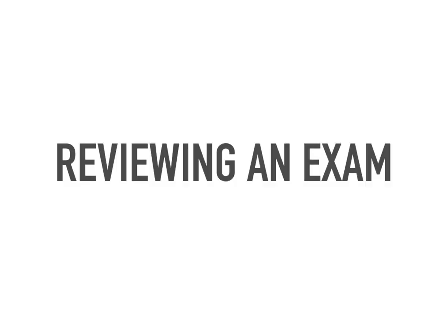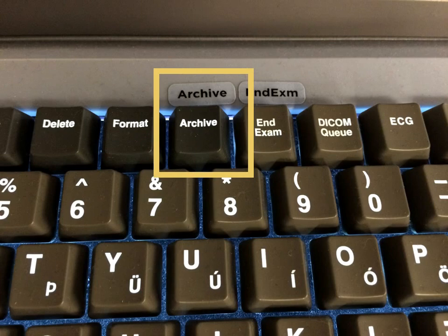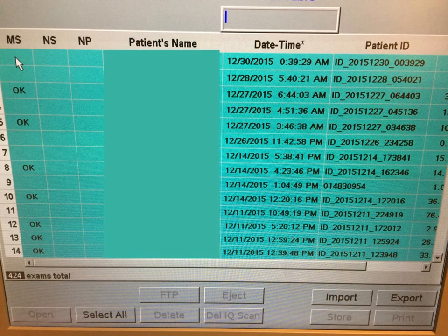Let's say you want to go back and review an exam that you or someone else performed that has been completed. Tap the Archive key at the top of the keyboard, and this screen will appear. Under where it says patient's name, there will be a list of patient names, the names that have been inputted when a bedside scan is performed. From here, it is possible to highlight a study with the trackball and Set button and open it for review. It is also possible to export it to a USB stick. If it is exported, you must click on the option to remove all patient identifiers from the images, and the machine will do it for you. To exit the archive list, simply tap Archive again.